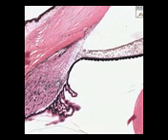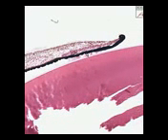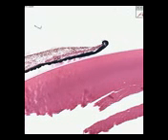Notice that there is this layer of epithelium which extends all the way from the retina, coming up through the ciliary body, all the way to the posterior portion of the iris, and this is called RPE, for retinal pigmented epithelium. And RPE is very unique because it is truly derived embryologically from brain tissue. And as you can see, the RPE wraps around the inner portion of the pupil, or let's say the distal portion of the iris, which is visible to clear view. This is the only place in the body, to my knowledge, where you could actually see brain cells.